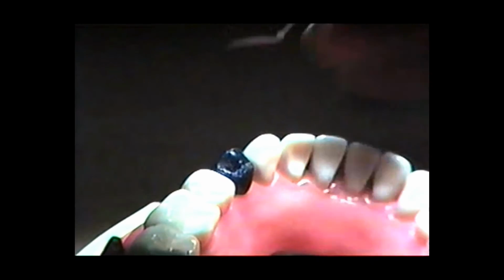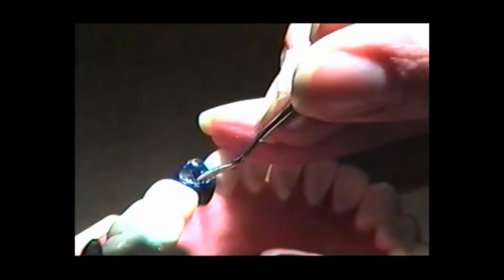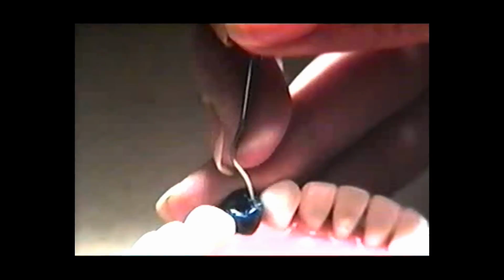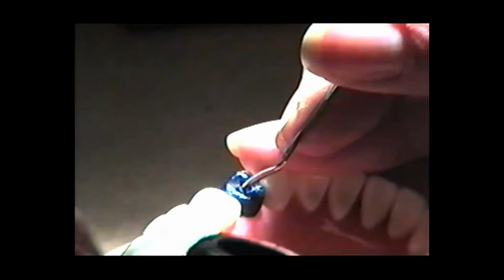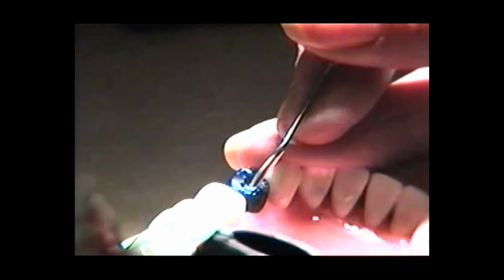The groove pattern, your bench instructors can help you with refining this, but you can get really nice looking occlusal anatomy just by spending a few minutes keeping it clean and getting your grooves just right where you want them to be. Clean out the grooves a little as you go. I just like to use a Hollenback or the Ward's carver. I don't use a cleoid, but a lot of people like to use that, so it's whatever you're comfortable with.